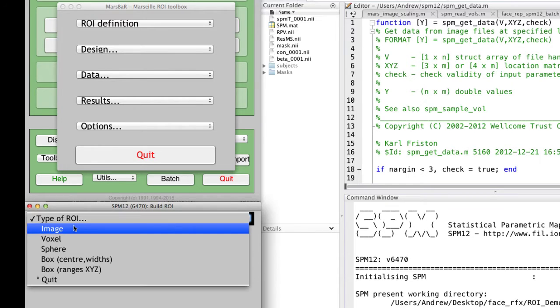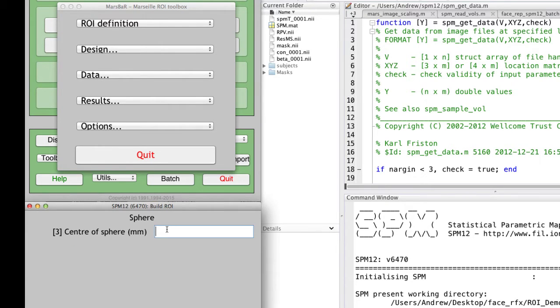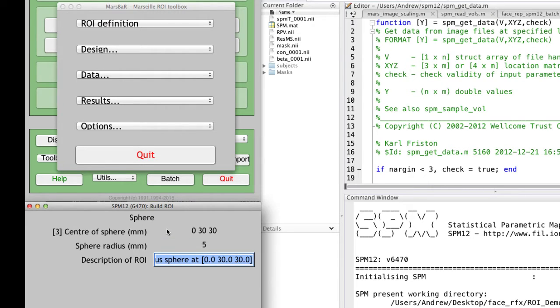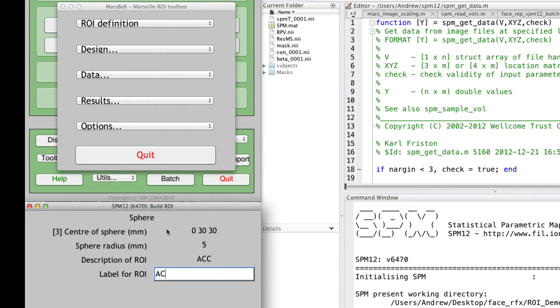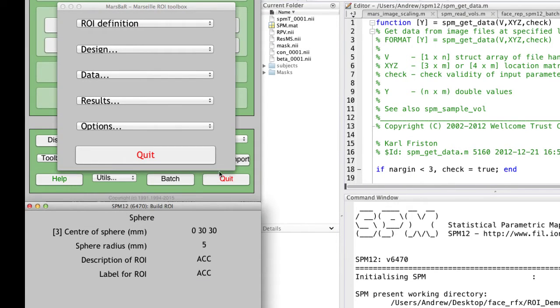Select type of ROI, a sphere, and then the center of the sphere in this example is going to be 0, 3, 30, and we'll select a radius of 5 millimeters. It's in the ACC, so we'll call it the ACC in both the description and the label, and save it as an ROI.mat file.